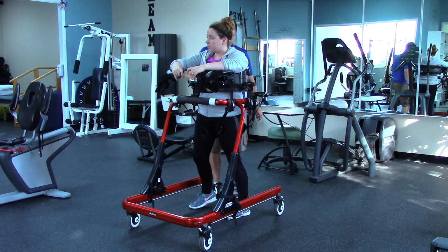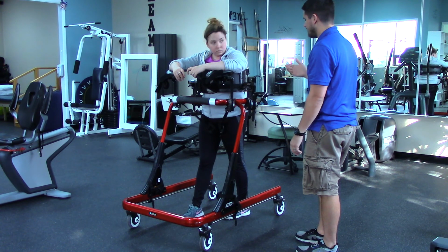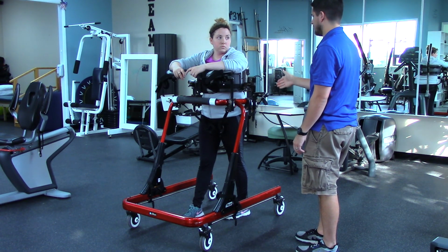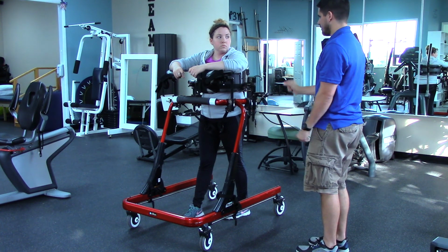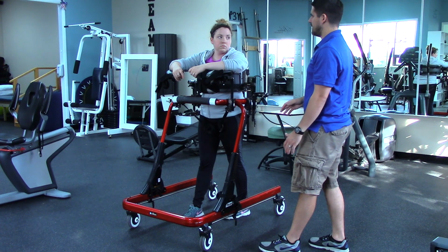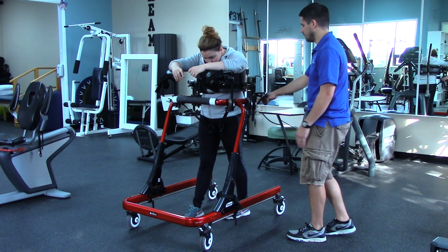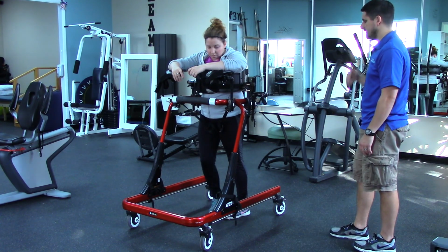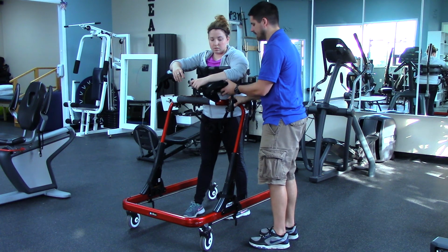And then this, I just want to be taut depending on who I'm working with. If someone's just needing a little bit of assistance, I'm going to make that taut, not real tight. I'm not going to jack them off the ground, because I'm going to try to find that distance in which they can walk, but not give them too much support. So you want to play with this and get it to the point where it's going to accommodate them.